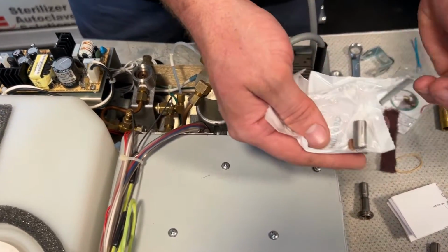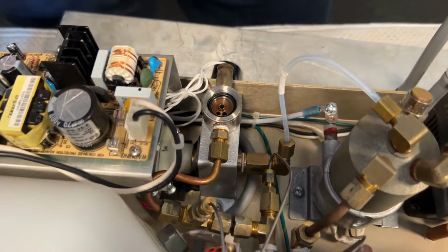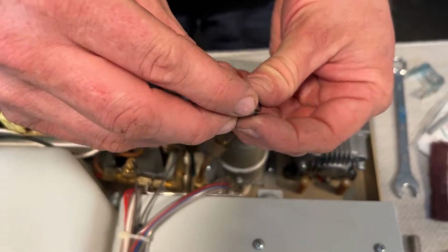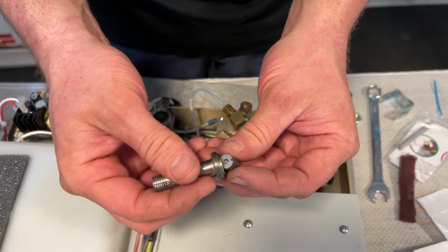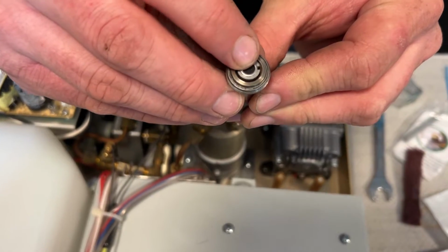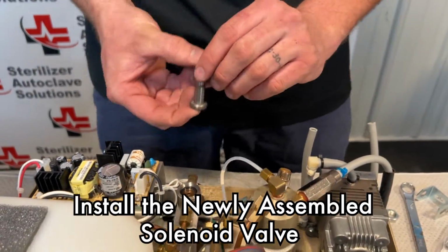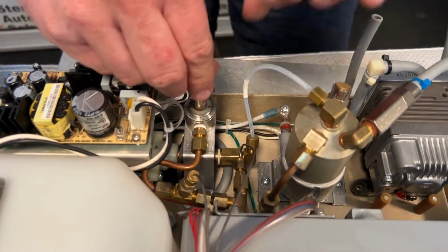Opening this, I'm going to take my O-ring and just set it inside loosely like that. I have my new plunger and my new spring. The spring will go in the plunger. With our clean solenoid stem, I'm going to push that in and flip it upside down. You should be able to press this up and down and it should move rather freely. To install, I'm going to keep a finger on this and just kind of place it over top and it will fall right into place.